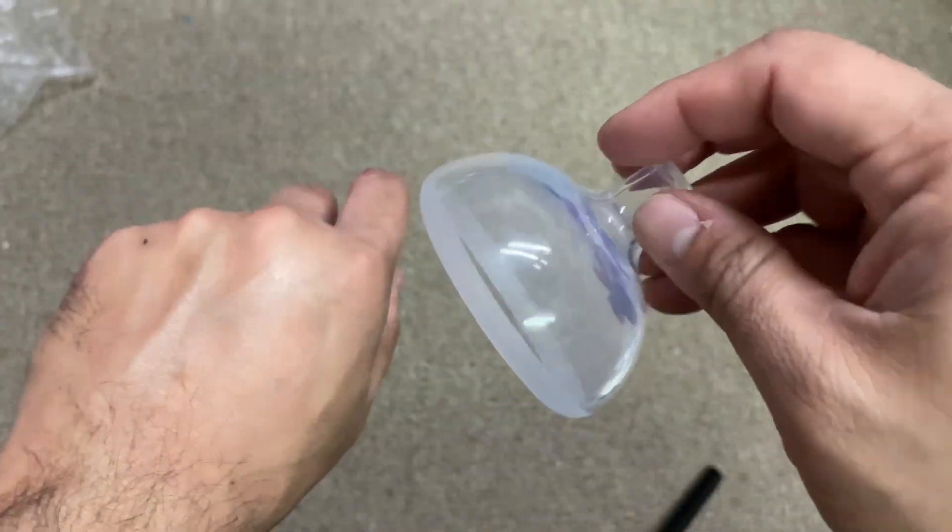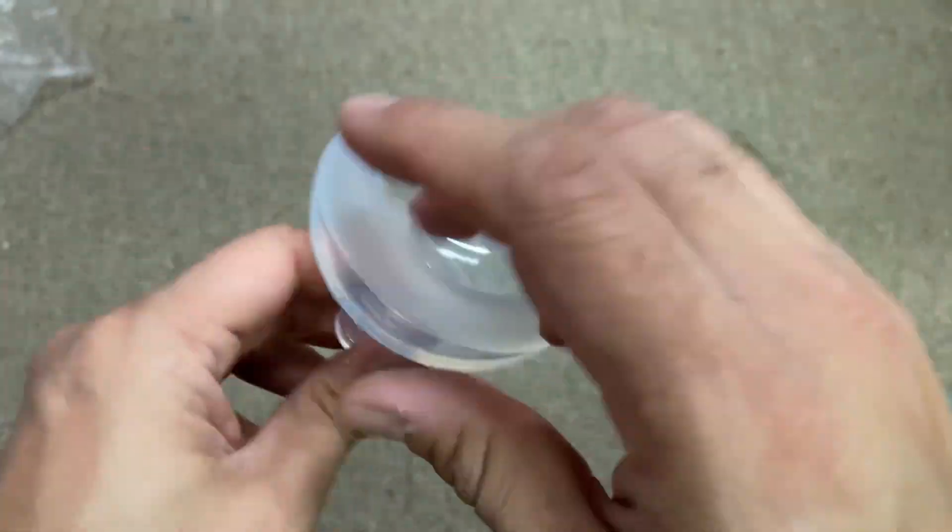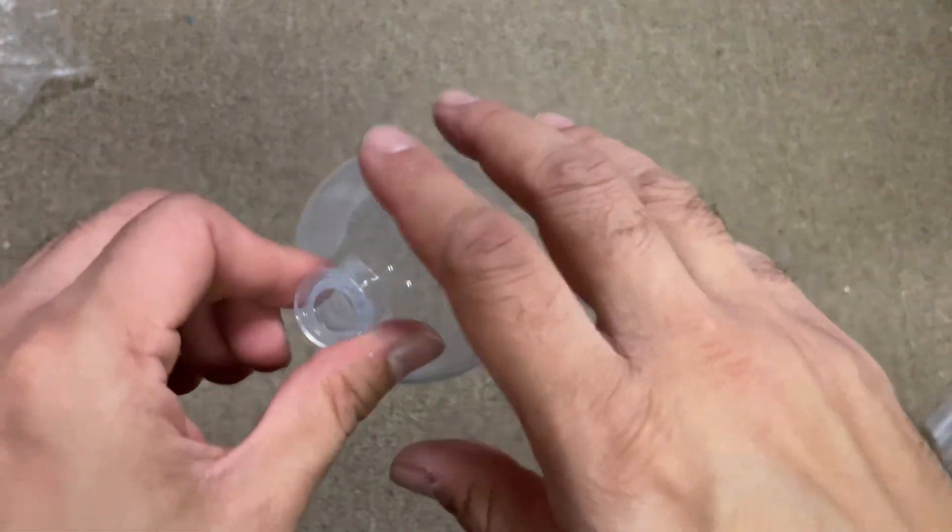It's a very nice, soft, and flexible handy tool to perform percussion.